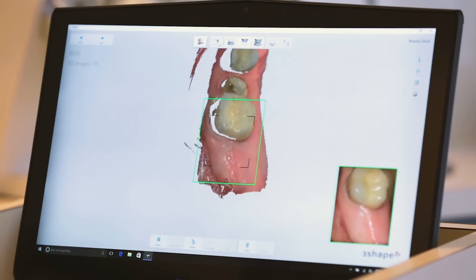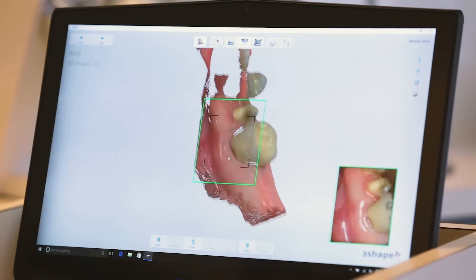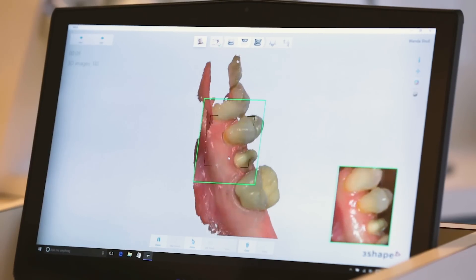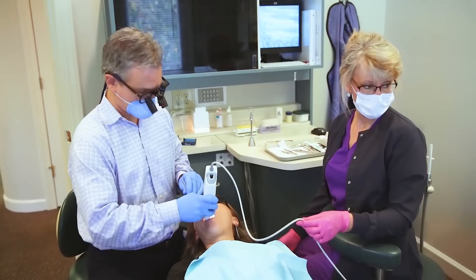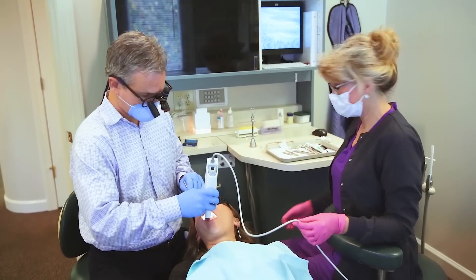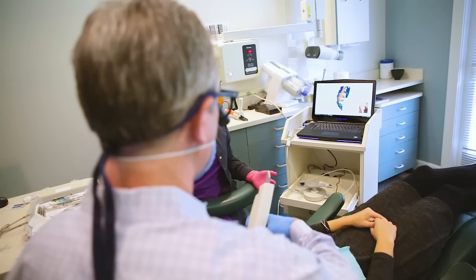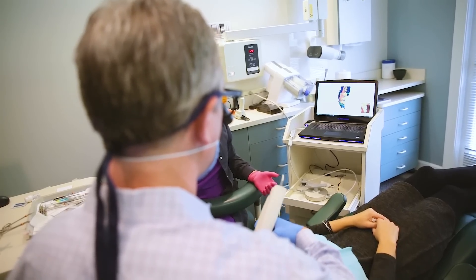Our fear in dentistry is that we have to become a lab technician, but with this software you can see that it's almost automatic.